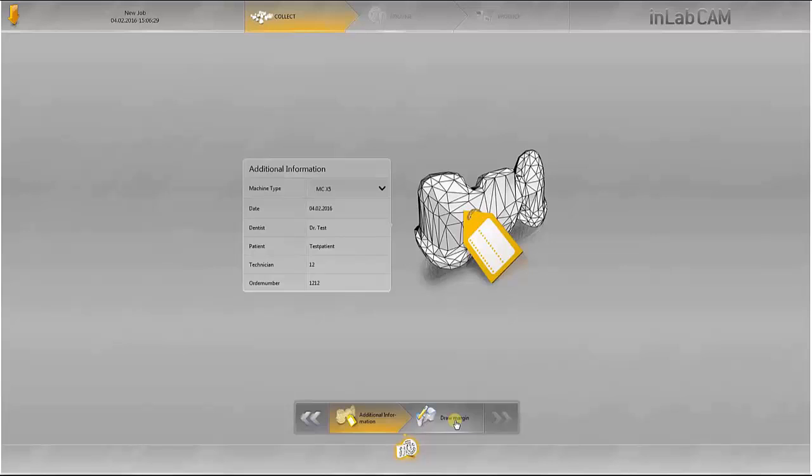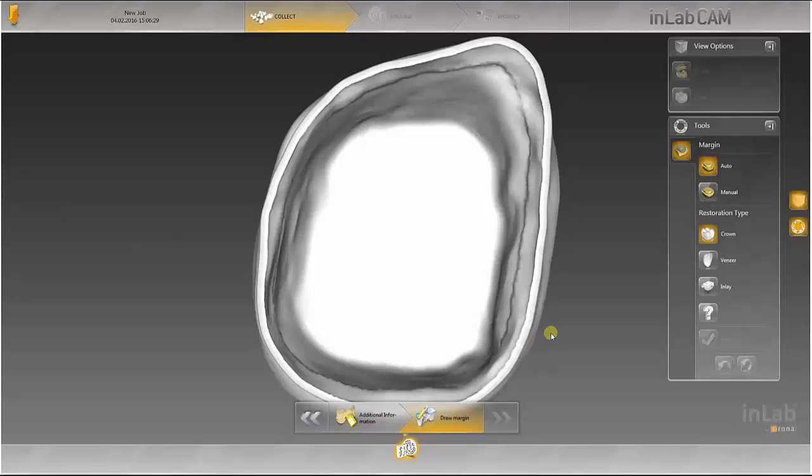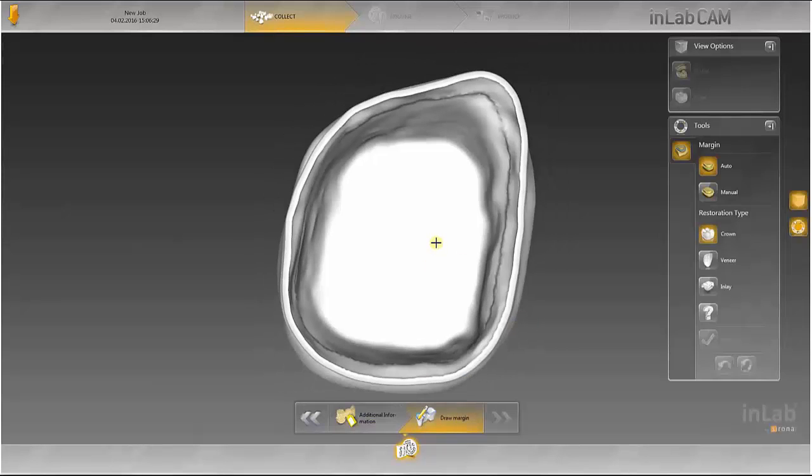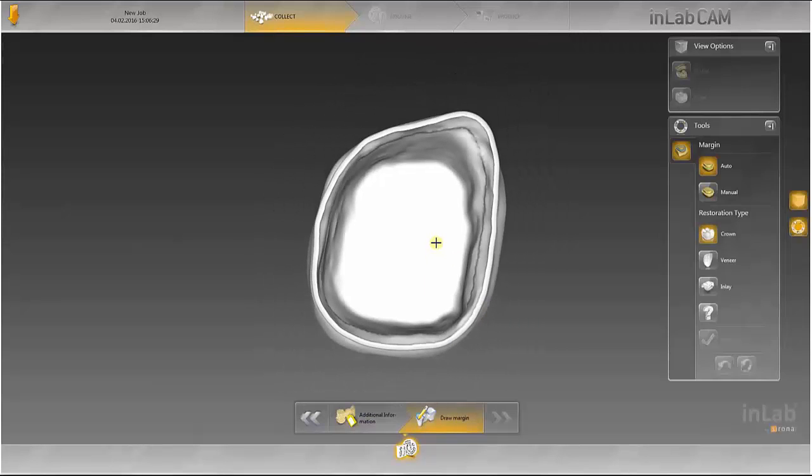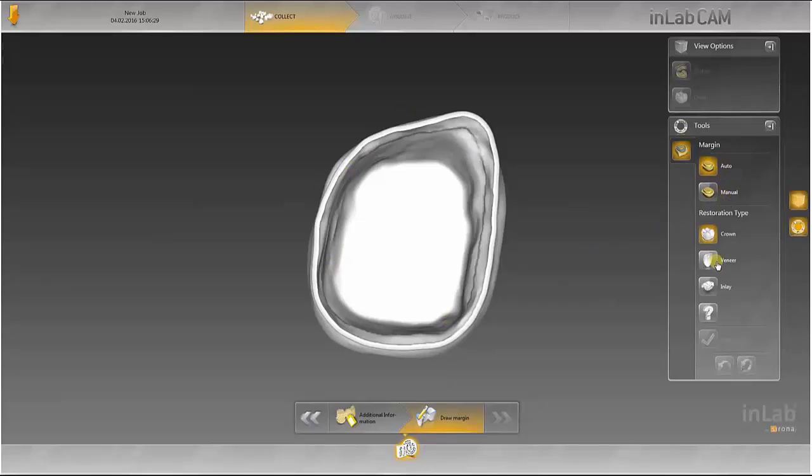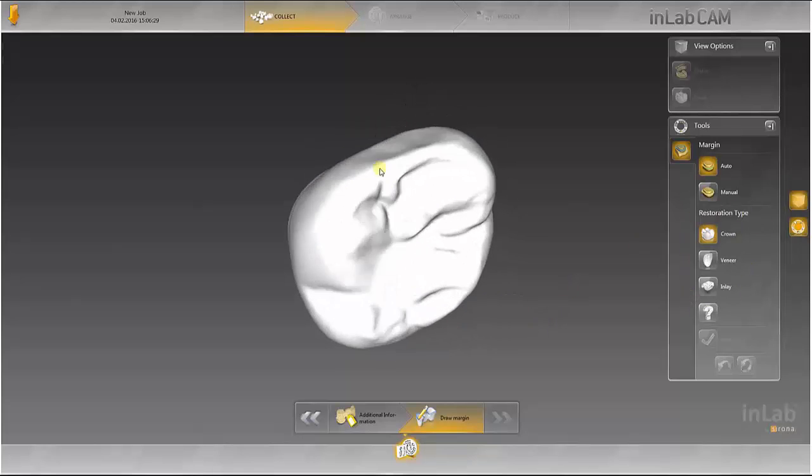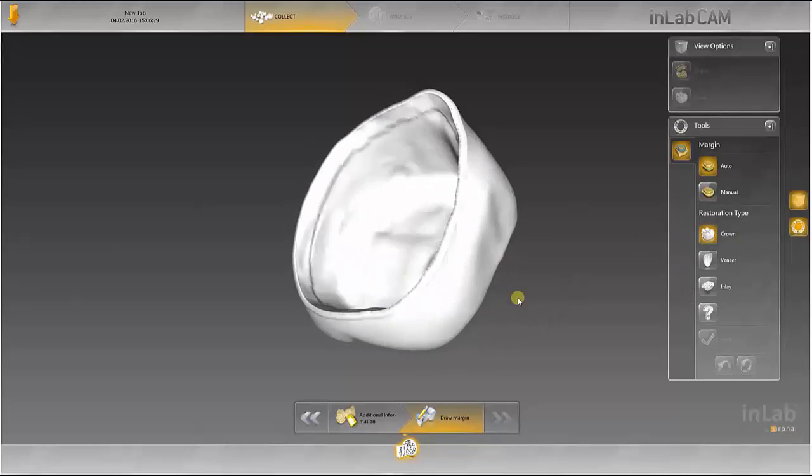The margin line is marked in the next step. An automatic and manual mode are available for this. You should first state the restoration type, in this case a crown.